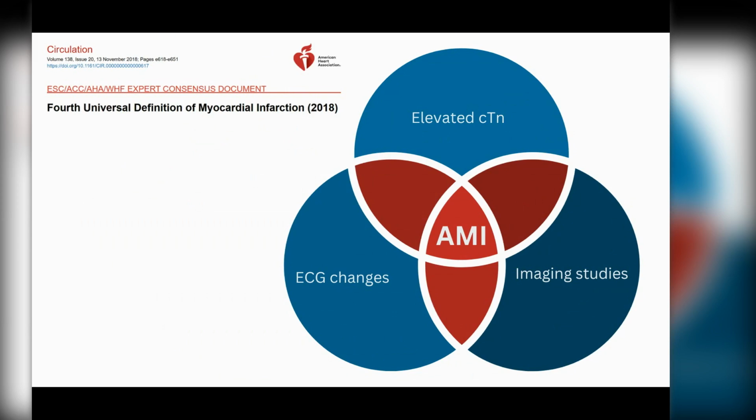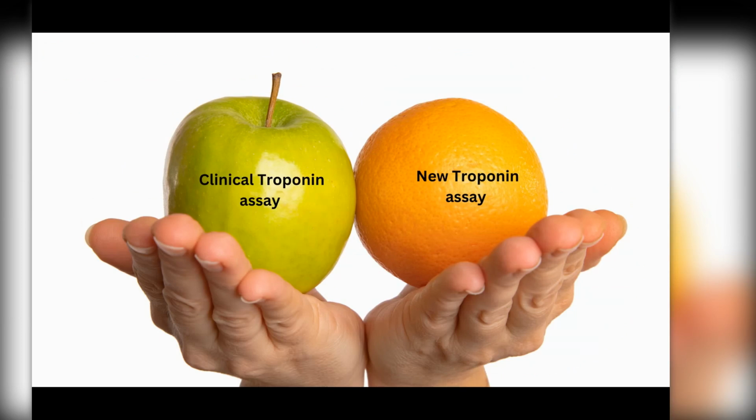And as we know, and Fred has just spoken about, the troponin assays are not harmonised, they are not standardised. They've each got differences in their analytical performance, and there are manufacturer-specific antibody and antigen epitopes to take into consideration. So essentially what that means is the comparator assay can never be better than the clinical assay. And that's an important thing to think about. So we're really saying that it's non-inferior. It's as good as, but not significantly worse.